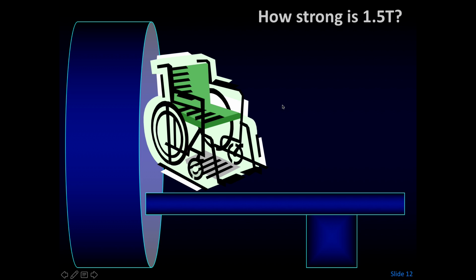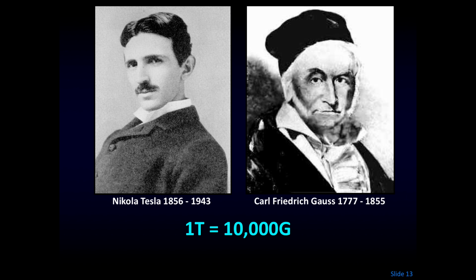It was unbelievable. So the point is that these scanners are really strong, those magnets are really strong, and if you're not careful, had that wheelchair hit the man instead of the magnet, it could have been a total catastrophe. So be careful with these scanners. These are very powerful magnets.